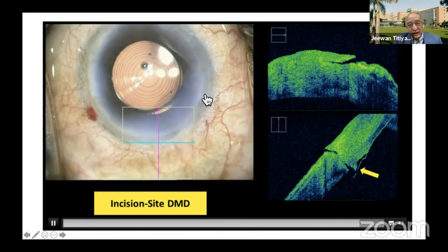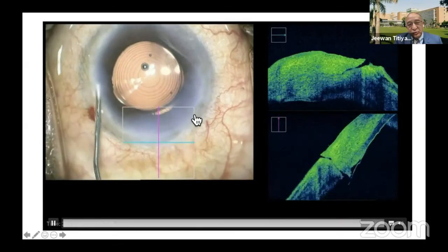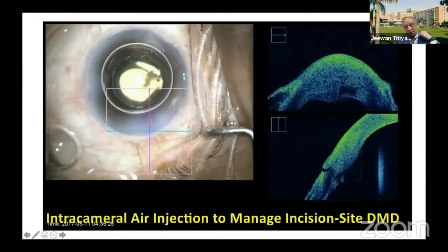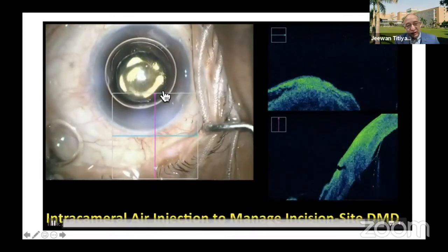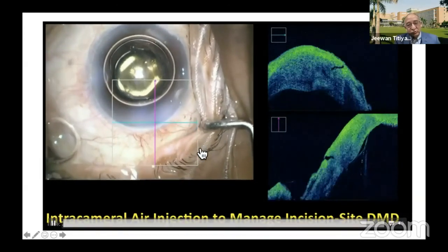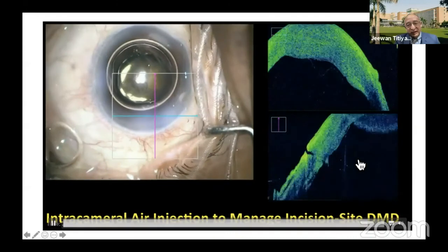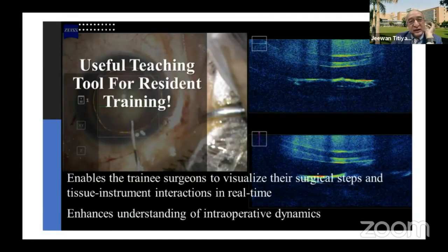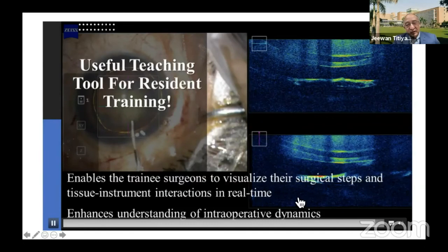Therefore, it is important to hydrate or increase the pressure from the side port rather than playing with the main wound, because that can increase the detachment. So sometimes you may have to inject air or gas to tamponade this large detachment which has happened. And this is only possible by IOCT. It gives you a real-time assessment of the entire surgical scenario. So I would say IOCT is helpful.